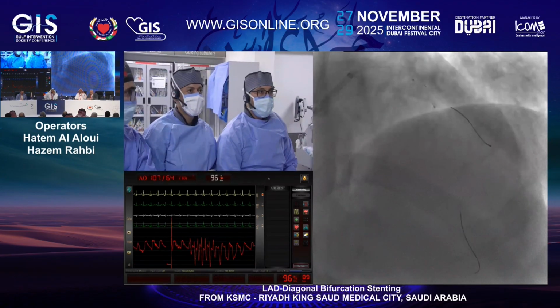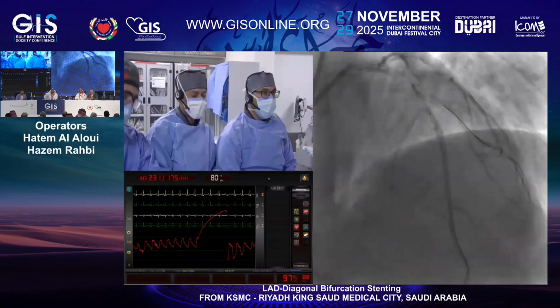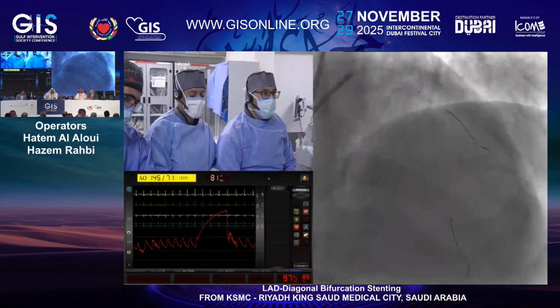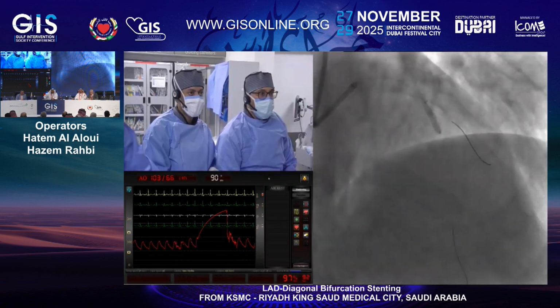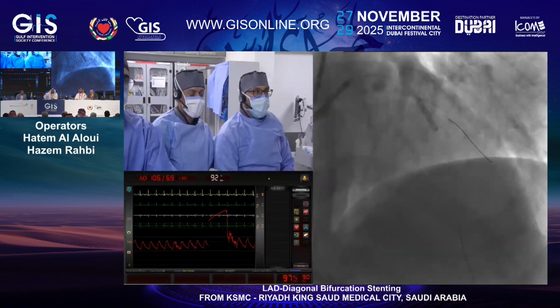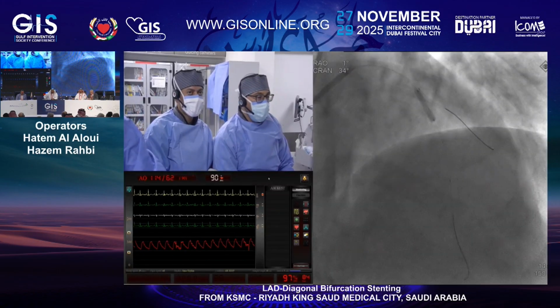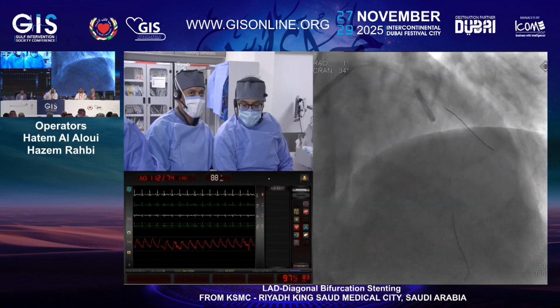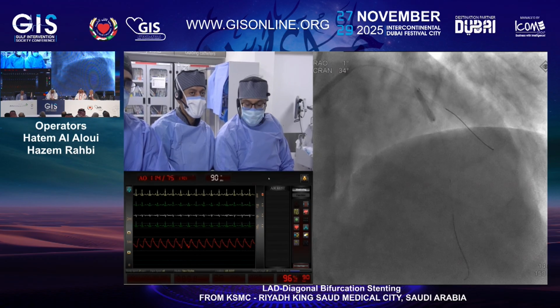I don't know if you can see it in the angio. There is some calcium there. By IVUS, there is as well some calcium. We want to prepare it very well and we want to avoid carina shifting. So I believe that by cutting this plaque, we make it softer, more prone to expand, and have less risk of carina shifting.